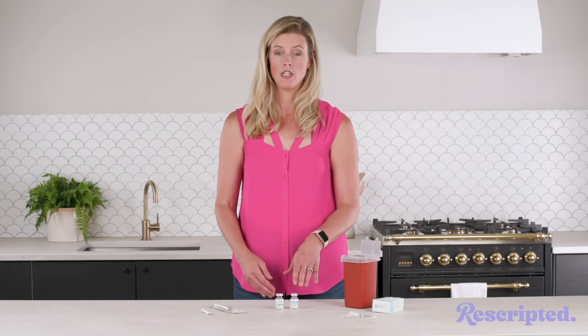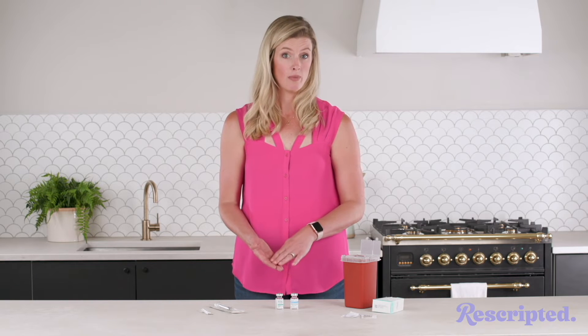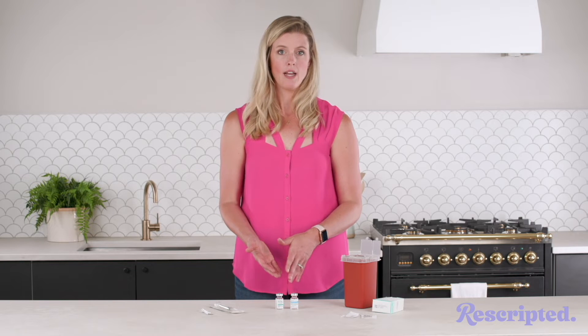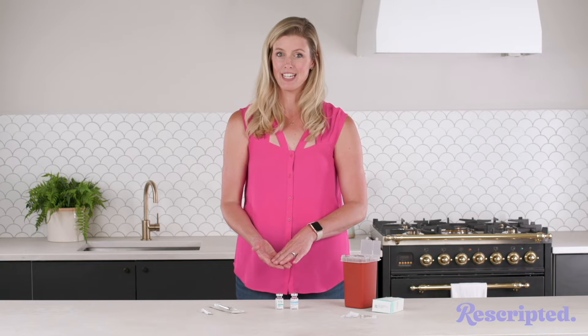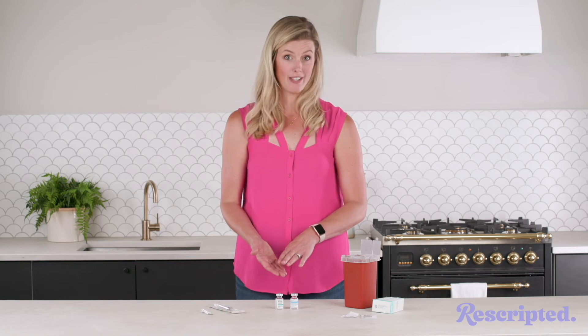In addition to that, you're going to need a syringe and a mixing needle — typically this is 22 gauge, one and a half inch, that's what we're using today, however this can vary. You'll also need an injection needle; in this case we're using a 27 gauge, one and one quarter inch needle, although this can also vary.